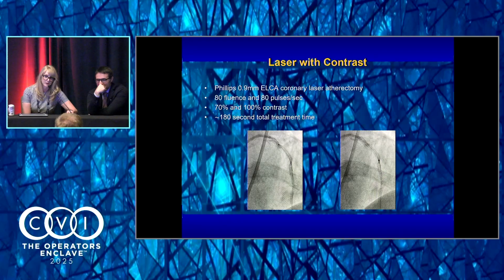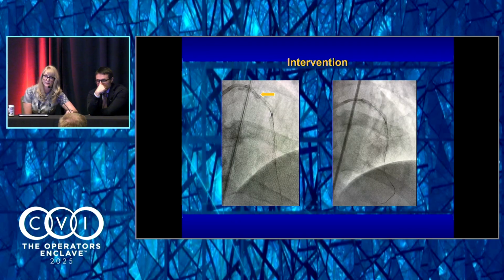I think there's a couple of potential contributors there. So you can see that there's a sharp angulation there partly, so that's potentially a bit of the issue, the tortuosity. The stents obviously do look quite underexpanded, and they're probably under some calcification as well. And it looks like, I'm not sure if there's a bit of an overlap of a stent there, perhaps. Bit hard to see from here, but I think there's multiple factors contributing to it. So maybe starting off with small balloons to create a tract and getting your guide extension seated a bit deeper, and you can go down the whole algorithm of gear won't go eventually with this.